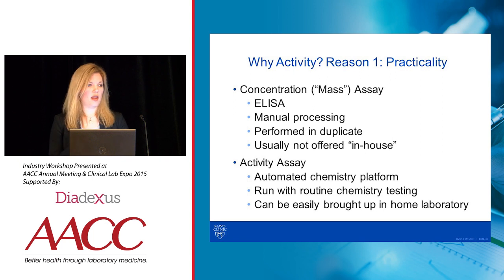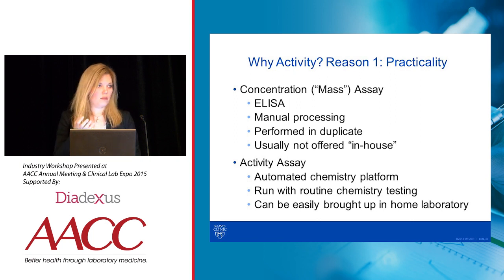It takes manual pipetting from your technologist in the laboratory. There's washing steps, there's reading steps, and these are pretty manual processes, and oftentimes samples are run in duplicate, looking for concordance between those results. It's usually not offered in-house because of this highly manual process, and usually is a send-out test.